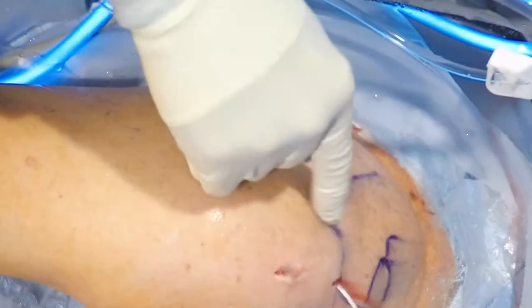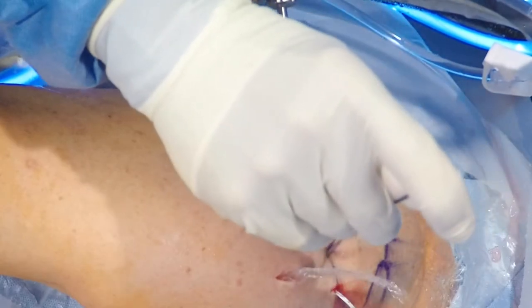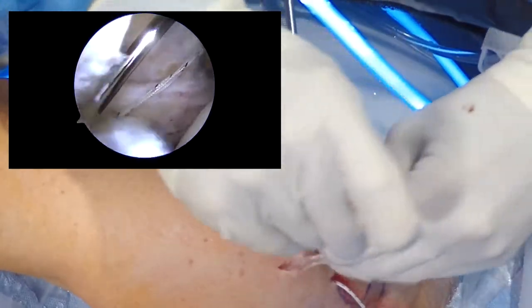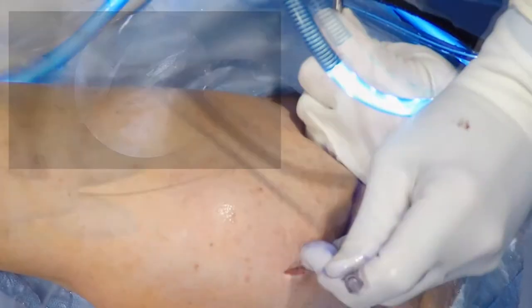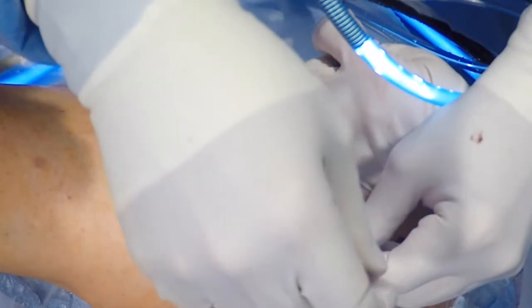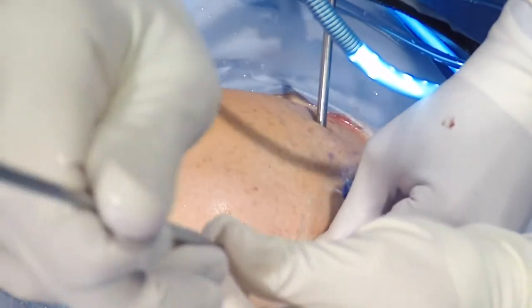Now we are preparing for the more posterior glenoid corkscrew anchor. We are ensuring that the anchors are placed far enough from each other, but in good quality bone at the superior glenoid. This is why there is importance to debride the superior glenoid so that you can visualize where the anchors are being placed.